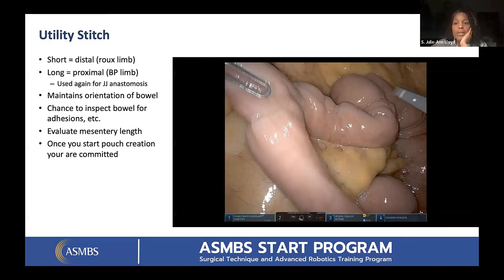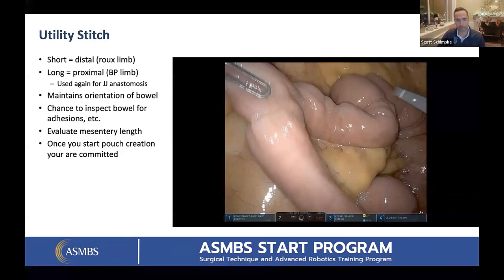So you just lay them on the bowel, or? Yeah, they're just laying on the liver, gallbladder, bowel. They're all pretty long stitches. You don't really go over there ever, and so I've never had a problem. They just kind of hang out there, and I go over there to the gallbladder and pick them up one by one as I need them.